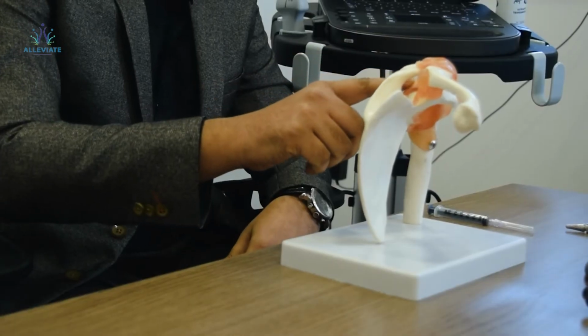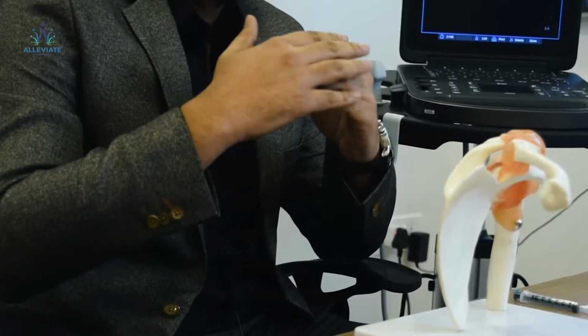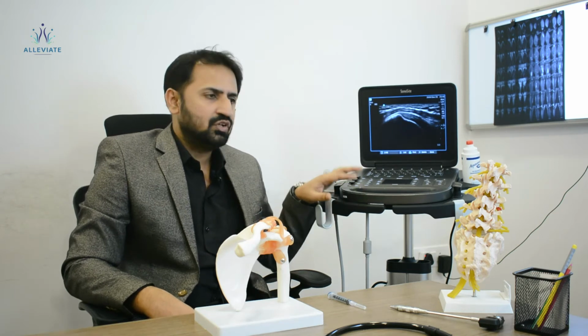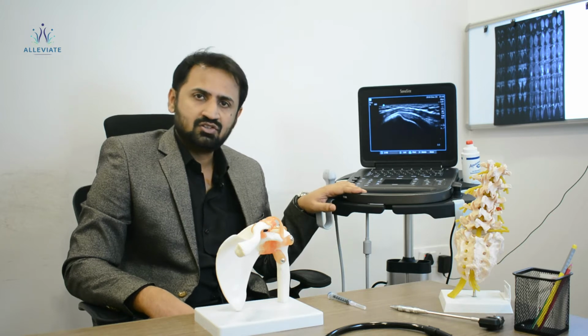With that, we also have a few bursas. Bursa basically means the space between two muscles is covered, and the cushioning comes from this bursa. That also can be a pain generator. In the diagnosis and in interventions, we use ultrasound. We have a Sonosite, which is one of the best portable ultrasound machines.